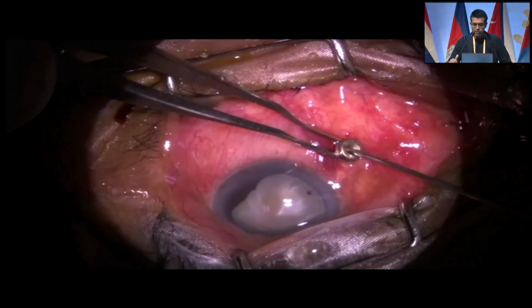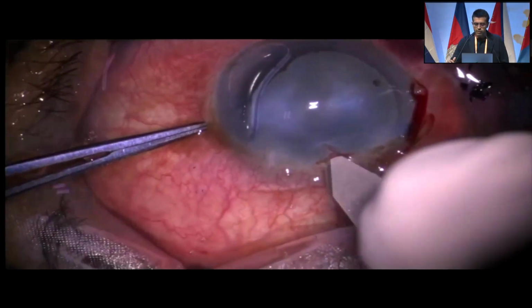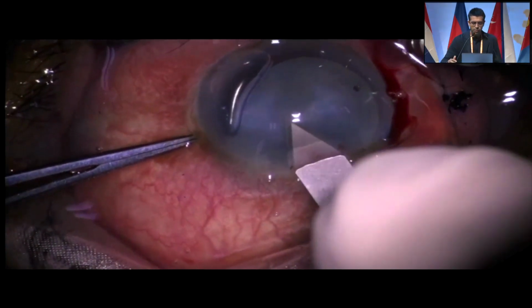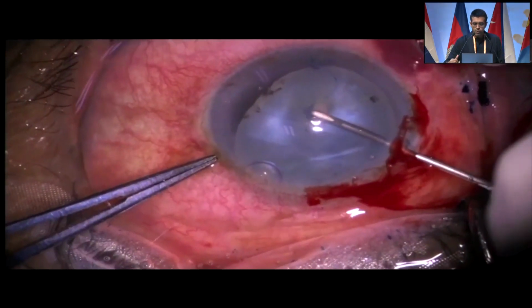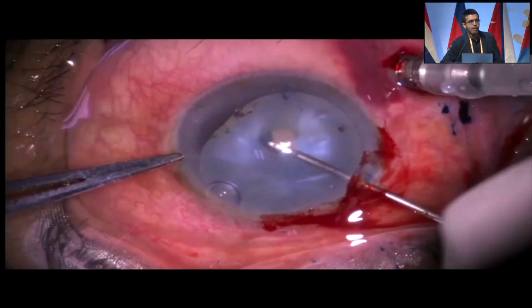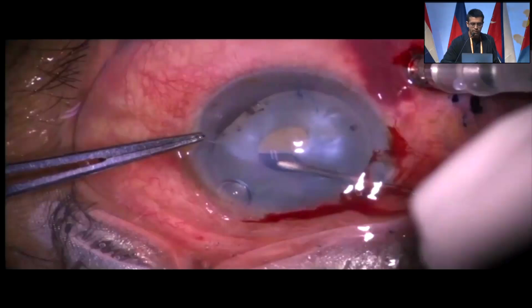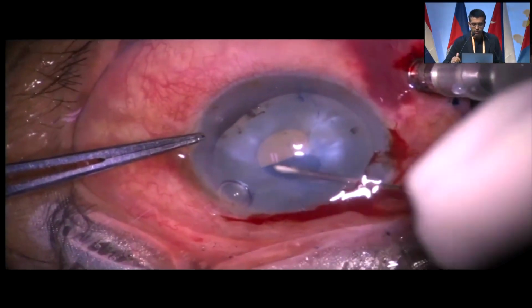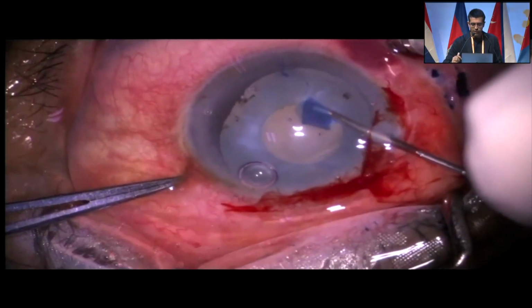Once the pressure is decreased and we can remove some vitreous, you can see now we can easily enter into the anterior chamber, and once we enter, we start attempting a rhexis. Even now it is not very easy because there is still high intraocular pressure, and once you start a rhexis, we can always keep alternating between doing a rhexis and removing vitreous as required. So very slowly, with dispersive viscoelastic, a rhexis is made.